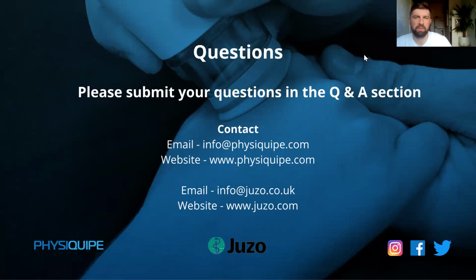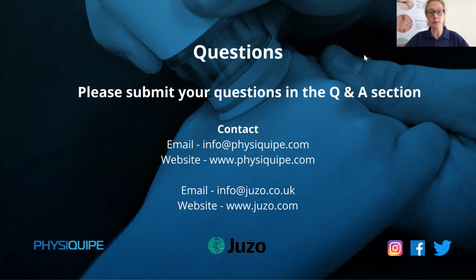And another question that's come in in terms of application. Hannah, can any of the devices work for cracked nipples, for breastfeeding mums? So I do the Mummy MOT, which is a women's health assessment, which is very in-depth, and I work a lot with mums. Would I use either one of them on the breast area? Probably not. The LymphaTouch actually lifts the tissue, so it works on positive and negative pressure, that almost wave type motion. You don't want to stimulate breast milk while you're working on cracked nipples. You want to make sure that you're not stimulating that area. You have to be super careful.